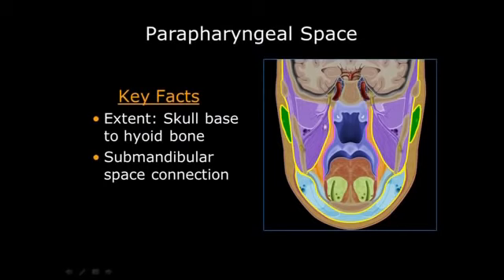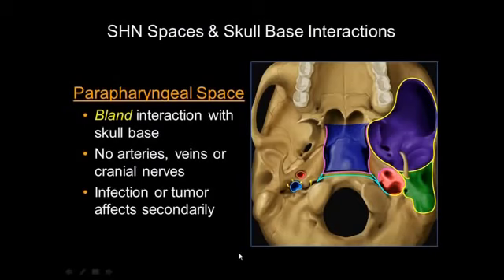The parapharyngeal space, as we said before, empties into the posterior submandibular space. So either tumor or abscess that gets there can display themselves as an angle of mandible mass, and really then would just be the tip of the iceberg of a much bigger lesion.